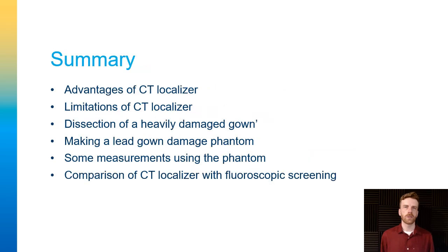In this talk, I'm going to review some of the advantages and disadvantages of using CT localizers for lead gown QC and show you a tool I made to assess the ability of a CT localizer to display damage in lead gowns. The images of this lead gown damage phantom were also a useful means of comparing damage detectability between fluoro and CT images.